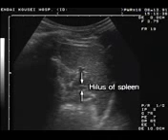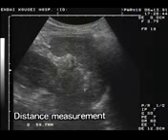Observe the images to see if the size is normal, the margins are rounded, and if the vessels at the hilum of the spleen are dilated or twisted. In particular, the branching vessels at the hilum of the spleen usually measure less than 5 millimeters in diameter. If they are larger than 6 millimeters in diameter, there is a possibility that the portal pressure is increased. Measure the spleen. If A times B is more than 30 square centimeters, splenomegaly is present.